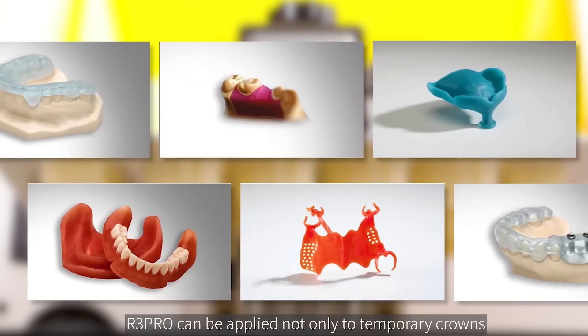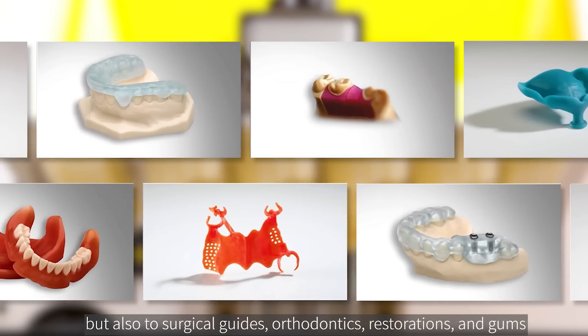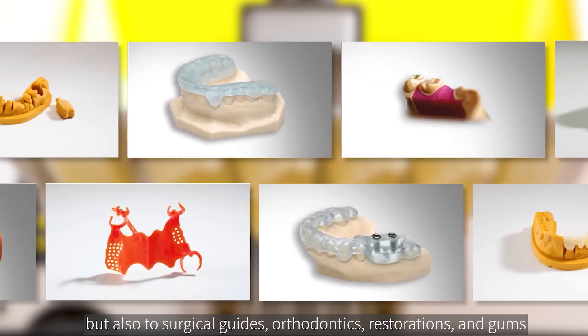The R3PRO can be applied not only to temporary crowns, but also to surgical guides, orthodontics, restorations, and gums.